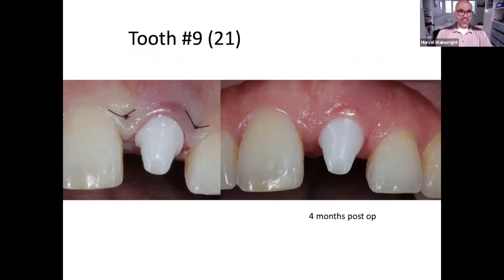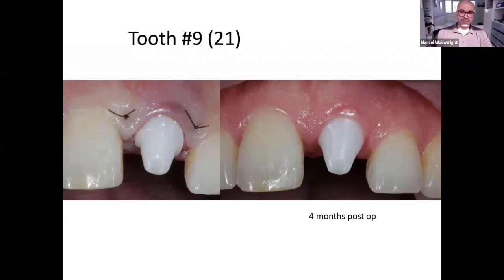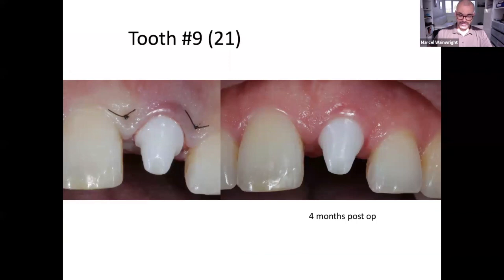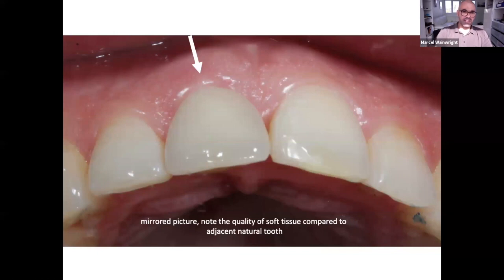Here you see this central incisor four months post-op. After several injections with hyaluronic acid, you can see a pretty much stable and nice biotype of gingiva and very stable soft tissues. You see the mirror picture as well.